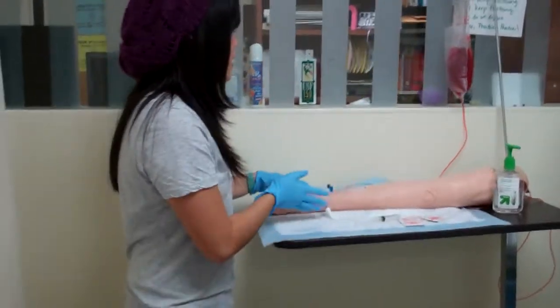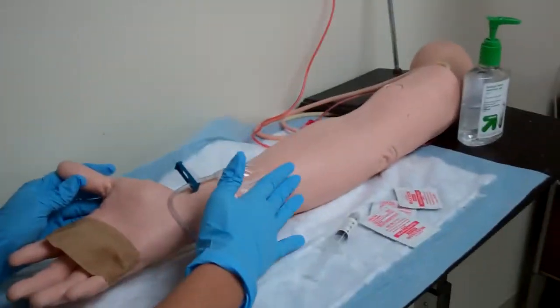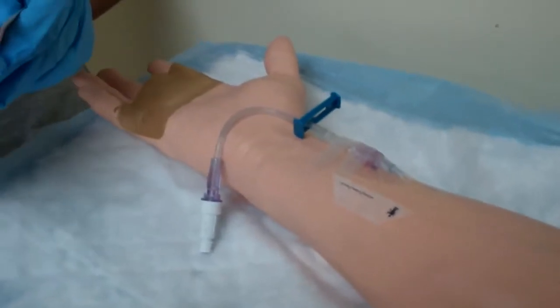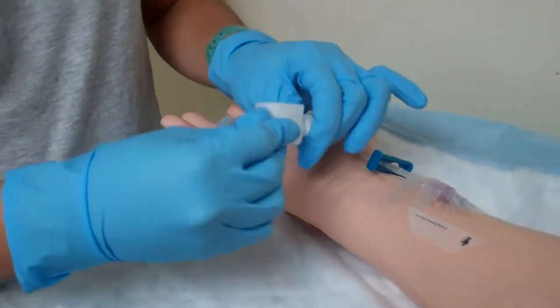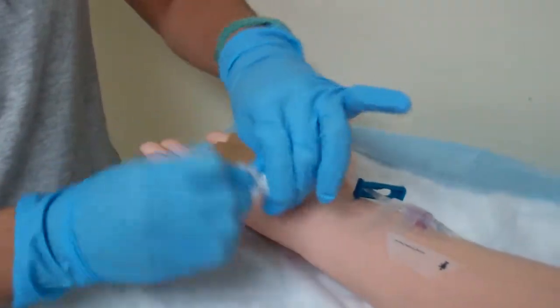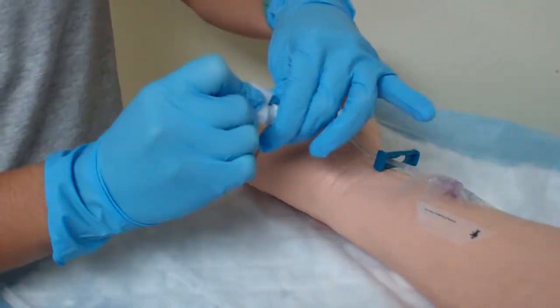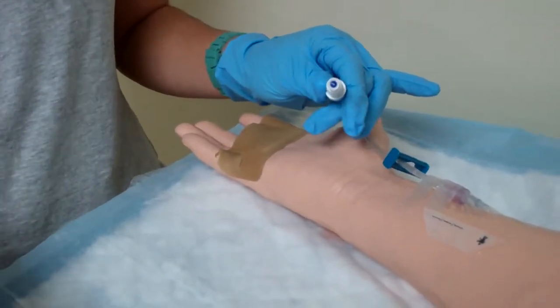I'm looking if there's any swelling, pain, or redness around the site, but this looks good. To test the patency, I'm just going to flush the line a little bit. I'm going to use my alcohol pad and clean the port with friction for about 15 to 20 seconds, and then I would also let that dry for 15 to 20 seconds.